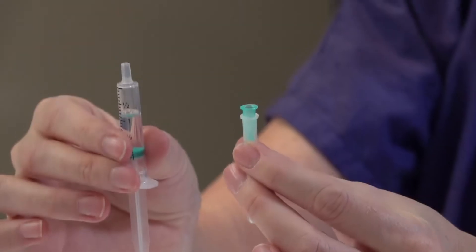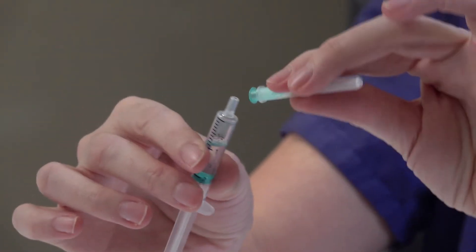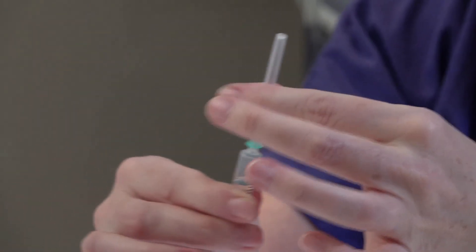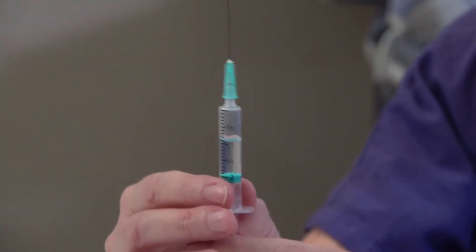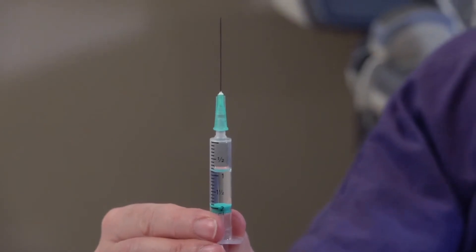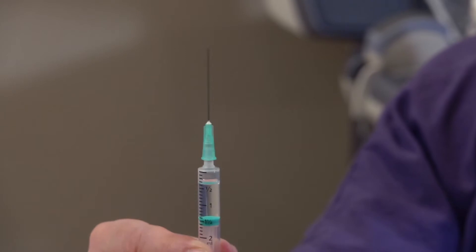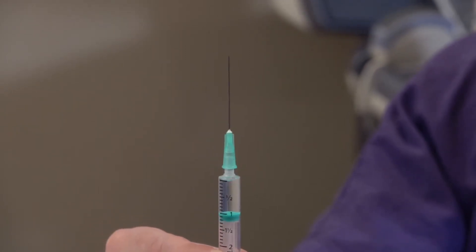Use the green needle to administer Prontogest. Attach this firmly to your syringe and then remove the outer cover. Push up gently on the plunger to expel any excess air. You are now ready to administer your Prontogest medication.